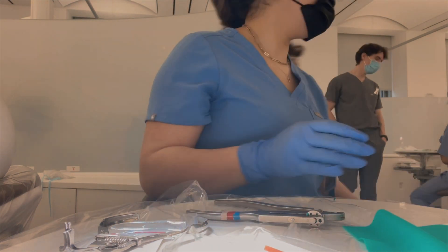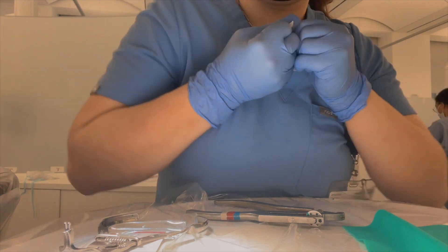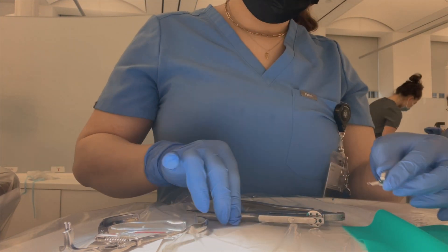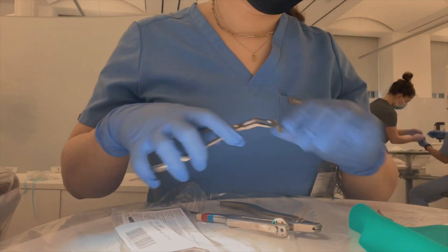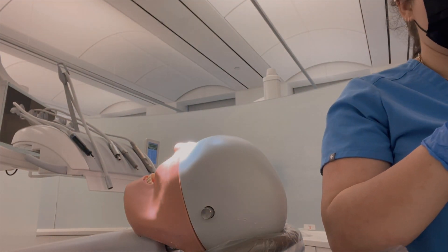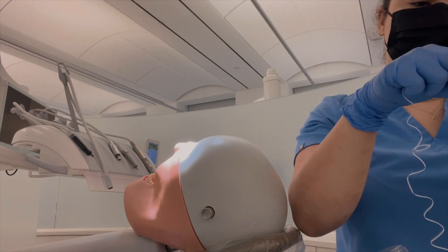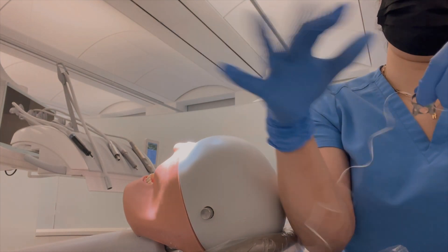It wasn't without struggle — I did have a pretty hard time. As you can see, it took me a while to get all the instruments out. When I took the clamp and started putting it on the tooth, I was hesitating because we're not working with a real patient, and I wasn't sure if I was too close to the gum line — and whether that would hurt a real patient. The clamp exerts a lot of pressure, and if it's pinching the gums that would be very uncomfortable. I was also second-guessing that, and it took me forever to get the floss all the way around the top of the clamp.